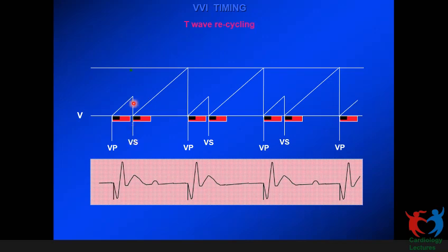But oftentimes, if there is a T-wave oversensing, it might fall within the refractory period. Usually, we don't see a reset of the clock. And in the older generation pacemakers, observing a T-wave oversensing is pretty rare, but it is often seen in an ICD and the modern pacemakers, which all companies are gradually shifting to, which is built on an ICD platform where the refractory periods are shorter or it doesn't exist at all. So that might happen occasionally.